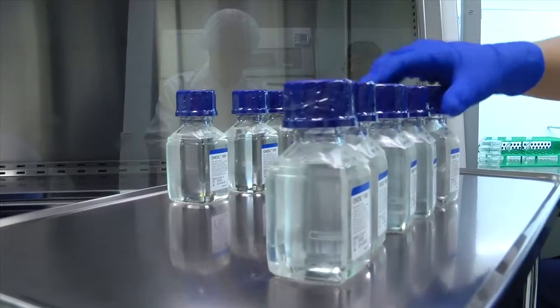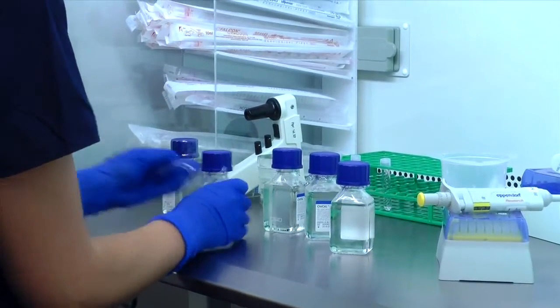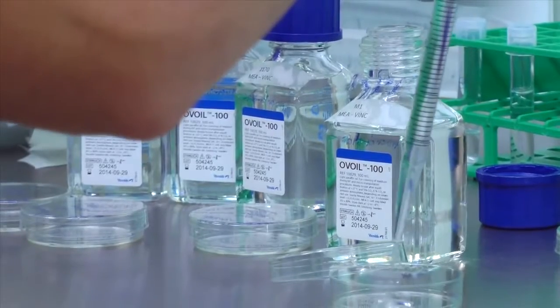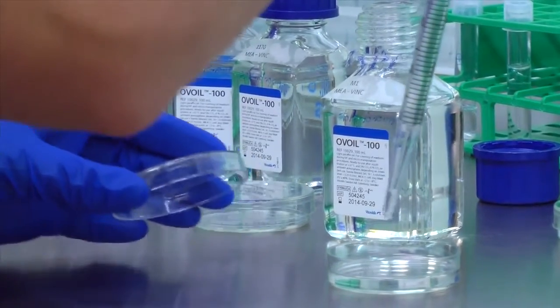The way we do MEA is to take a raw material and expose it to our simplified media and utilize that media in the culture of one-cell mouse embryos. The mouse embryos are placed into a culture environment for 5 days, and at that point we determine the number of blastocysts that have developed on day 5. The development of blastocysts to day 5 is used as the criteria for release of finished products.